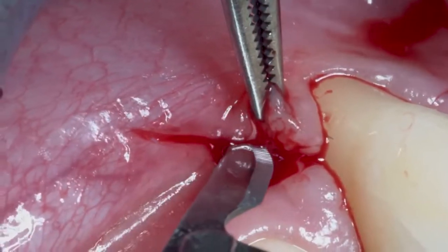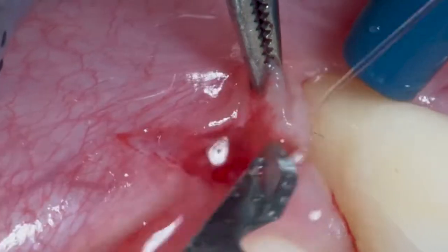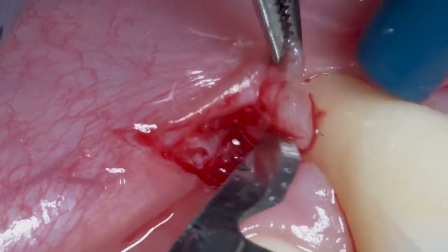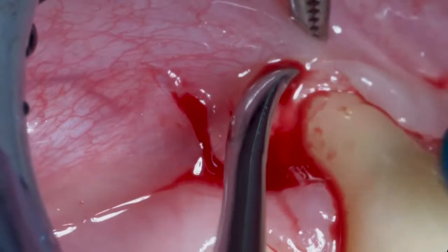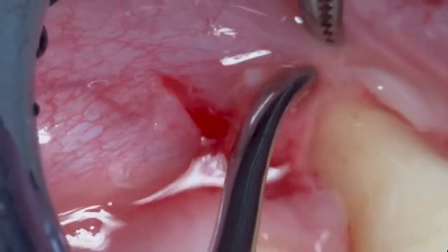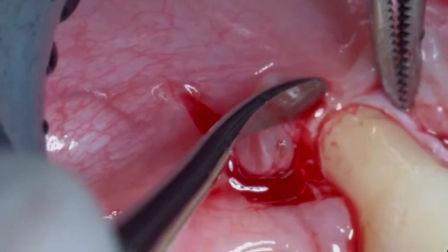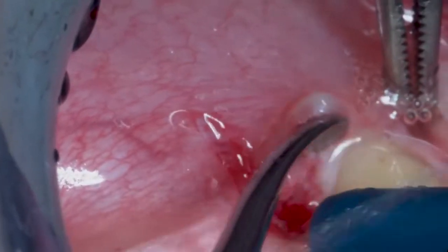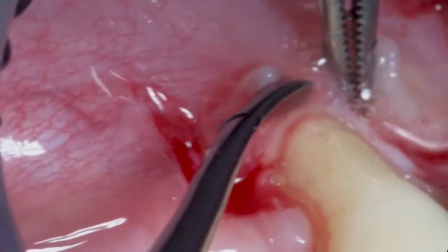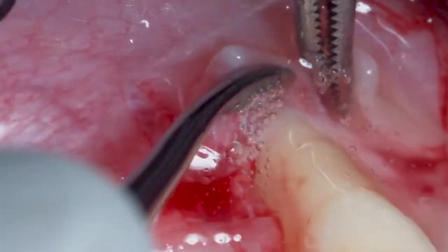You need to be very careful in keeping the flap with the tweezers, and you need to use surgical tweezers, not anatomical tweezers, because with anatomical tweezers the flap slips and you lose it. If you press too hard you may damage the flap. You need some teeth on your tweezers to grip the flap well, and use very few suture strands.